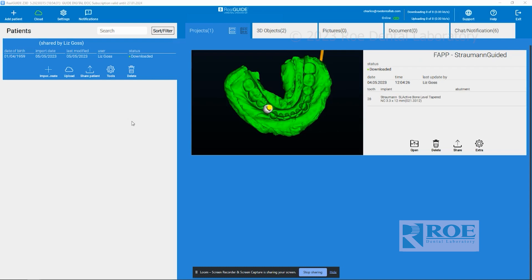Today we'll be learning how to open and manipulate an implant in RealGuide. The first thing is to click on your cloud button — you'll notice that a plan will have come in, shared by one of your co-workers. You can see who shared it and the patient name. From there, you can come over here to open.